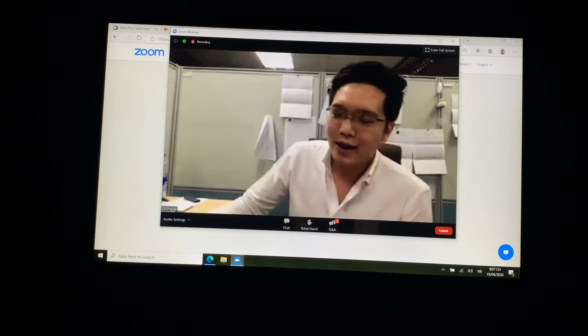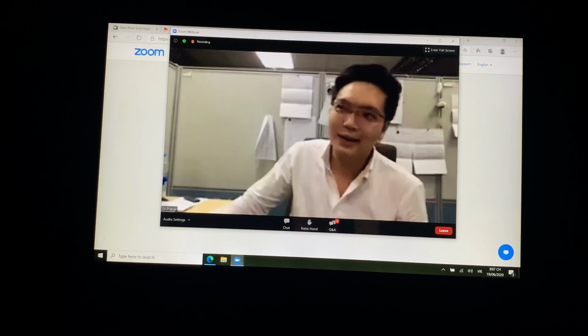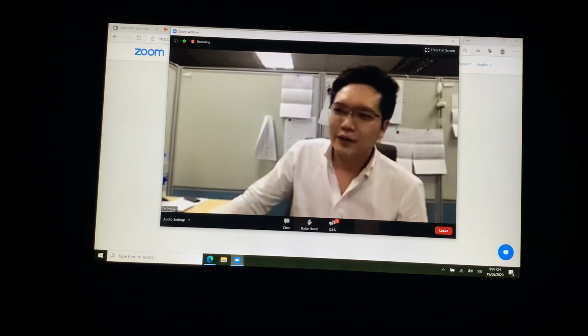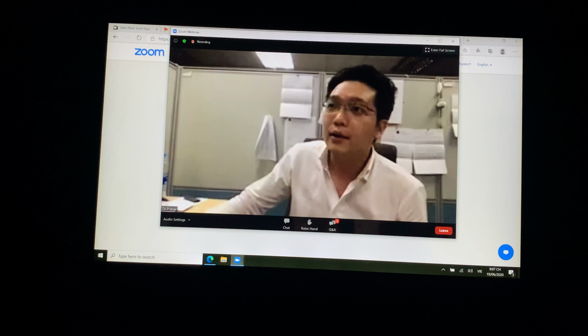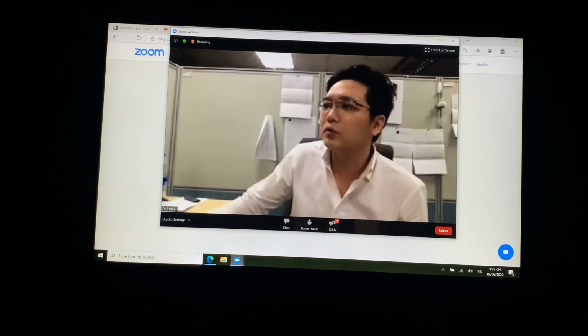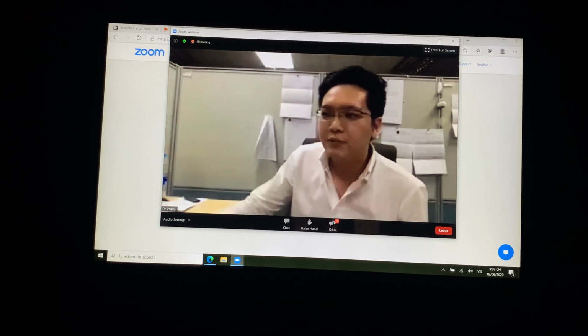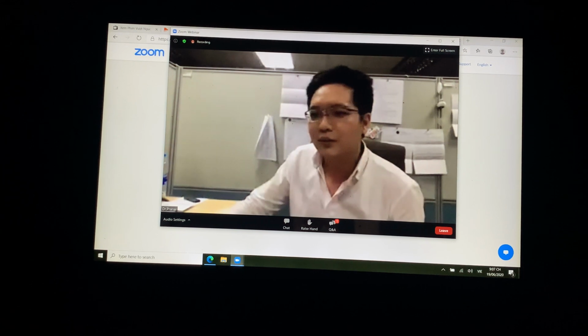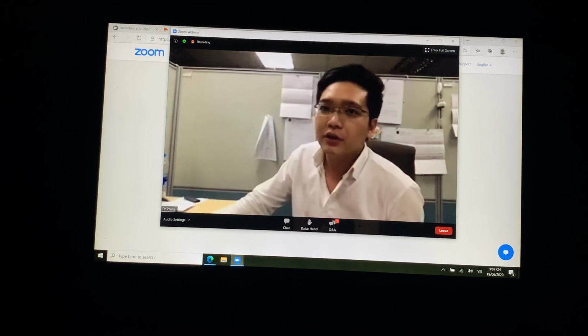Traditionally, when I was doing my residency, I used resin with an indirect technique. However, I feel like it takes longer that way. Now, normally what I do is use a composite resin. Let me actually show you the slides. This is what I normally use right now. I just use composite resin and use flowable to capture the emergent profile. The emergent profile that I usually get is similar to something like this. We only capture the important part, which is the critical zone.